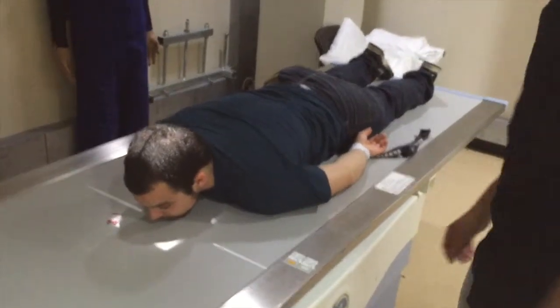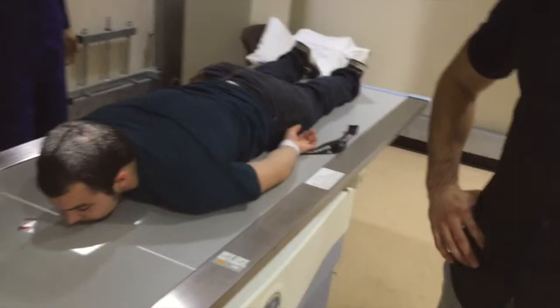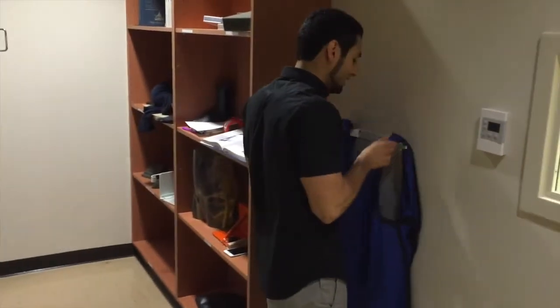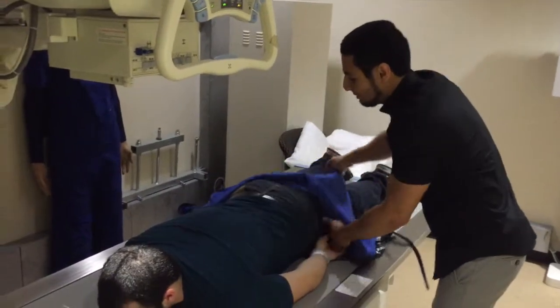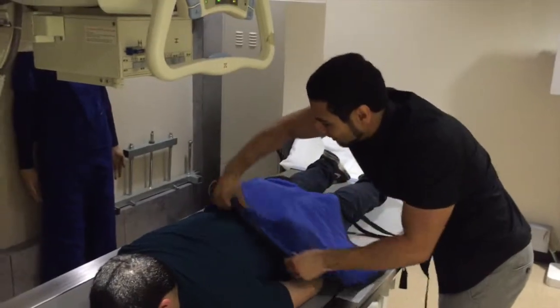Making sure the tube is aligned. We don't want to make a double exposure, and we will proceed to exposing the patient. We also want to shield the patient. We want to make sure that their gonads are in perfect condition for reproduction. So we can place any sort of lead material as long as it's not obstructing the anatomy of interest.